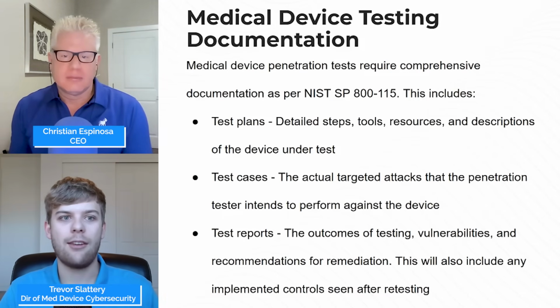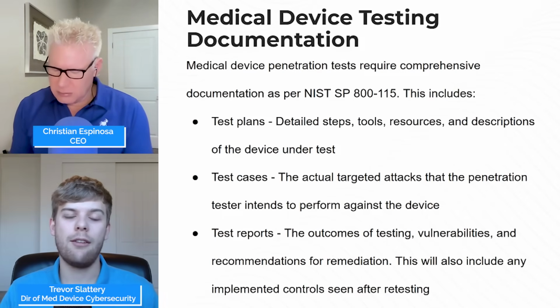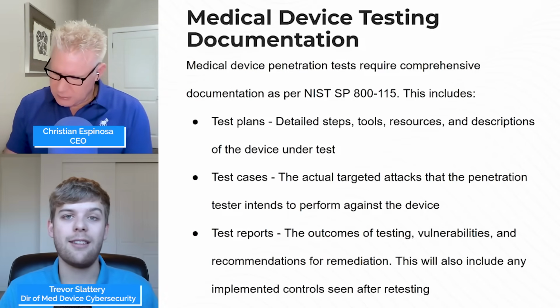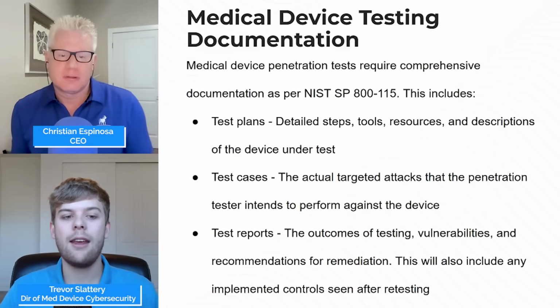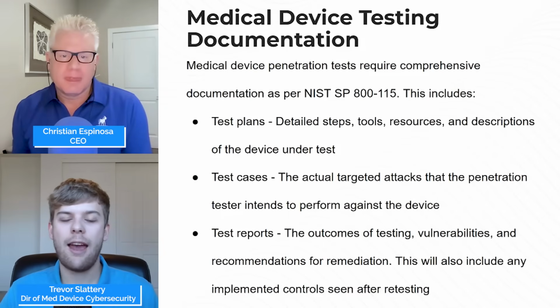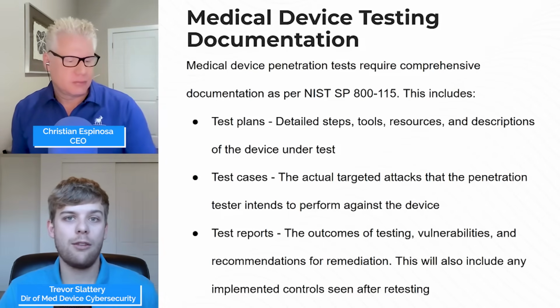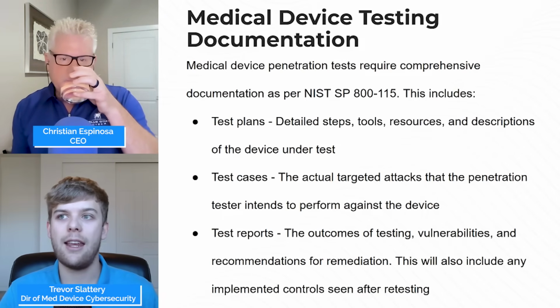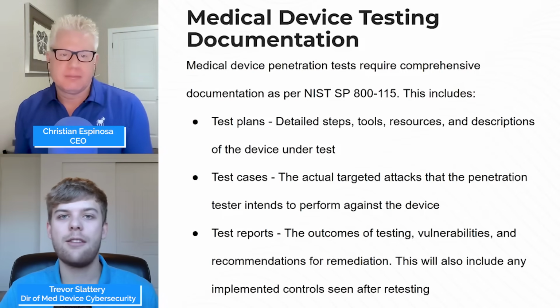It's very important that we talk about the experience of the penetration testers. We make a keynote of their independence from the organization. This is a very important distinction, as it is required that penetration testing is done by an independent third party. It cannot be done internally. So we're talking about everyone that's going to be involved in the penetration test, every tool, every system, as well as what we're testing. This is one of the resources that we have. The device itself and any accessories or credentials that we are provisioned are part of our resources. So this is mapping out everything before we go in and actually do it.